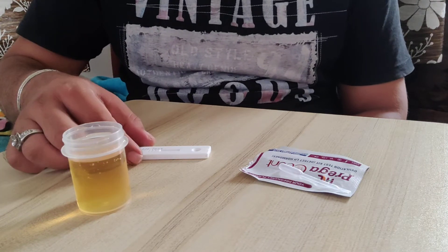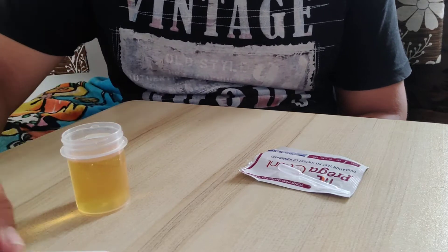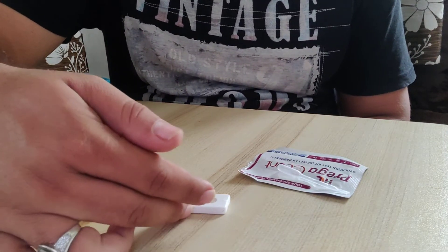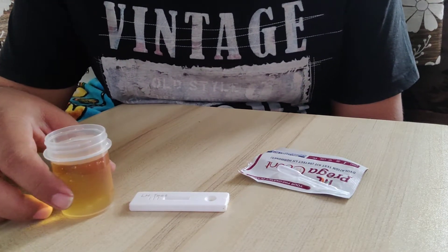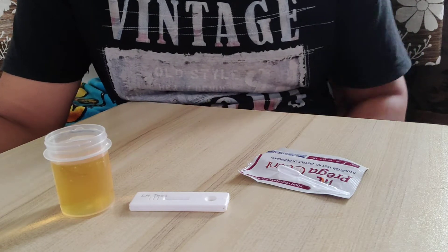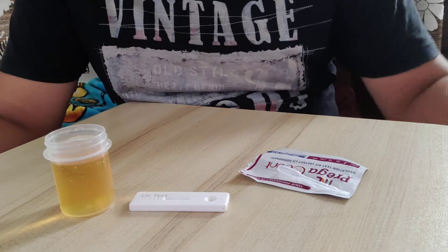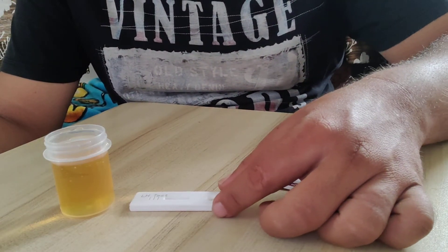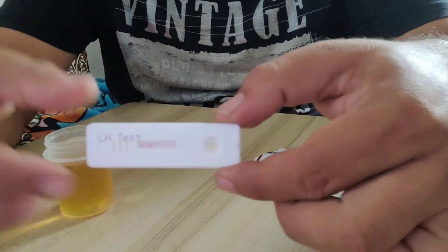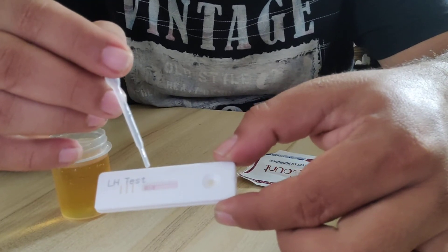Just wait. You should not touch the cassette at that time because if you do so it will interfere with the test. Within five minutes you will get the result. You can see the band has already started to appear.